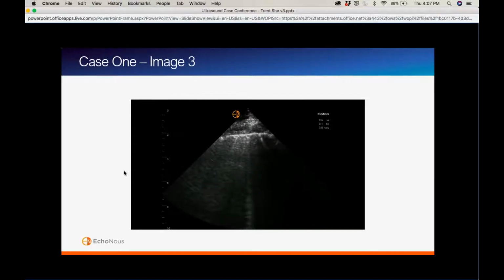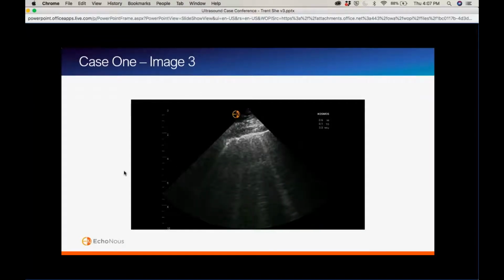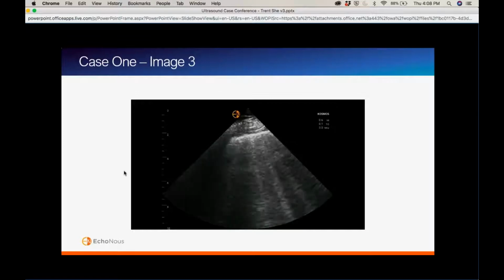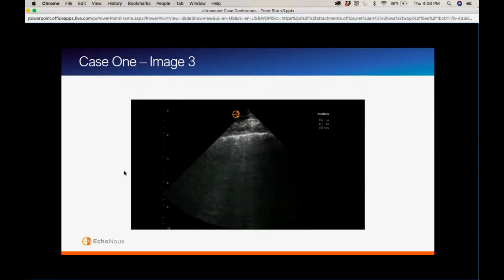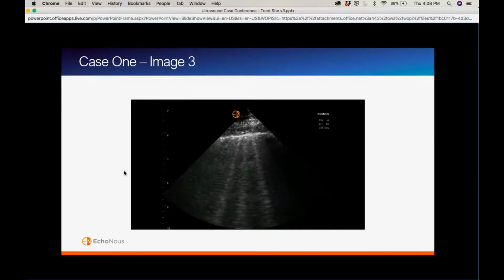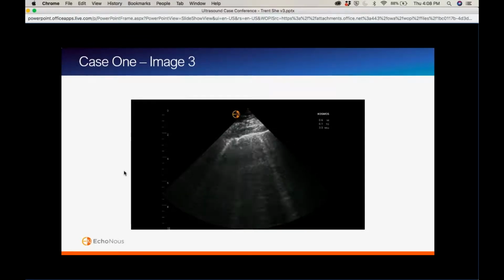So if I'm understanding this correctly, this patient came in acutely decompensated, dyspneic, hypoxic. You initially get this apical 4 view that shows this large RV with McConnell sign, which is pretty specific for a pulmonary embolism. Then you put the probe on their lung fields, and now you're seeing diffuse pulmonary edema or B lines, which could be pulmonary edema, fibrosis, or pneumonia, but probably we're thinking fluid in someone who has an acute change.